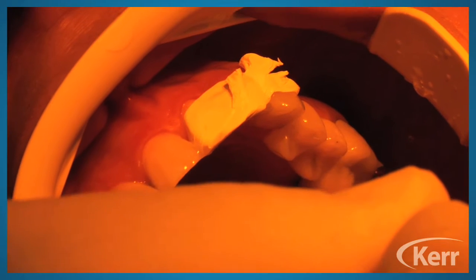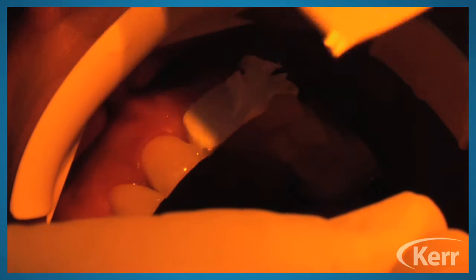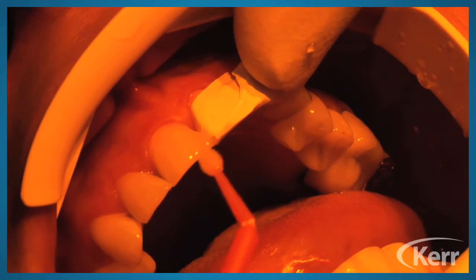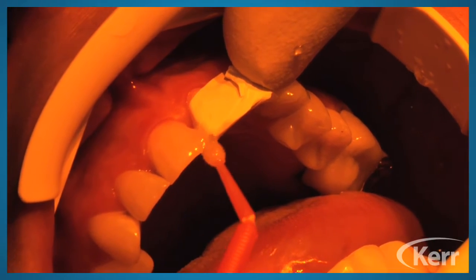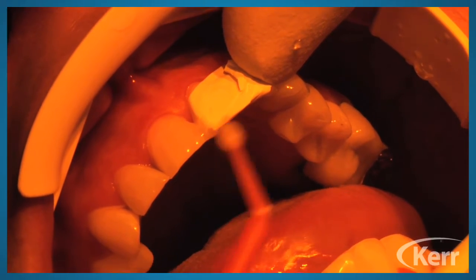But you want to make sure that you open these wrappers up, okay, right on the spot. So don't open them up in your operatory and leave them open. Sometimes the assistants think they're being efficient by having them open up prior to using them, and that actually is going to change the chemistry a little bit. So keep them in the aluminum foil wrappers until you're going to use them.